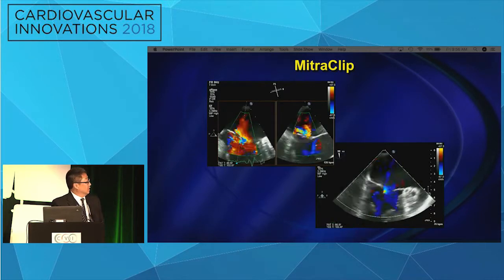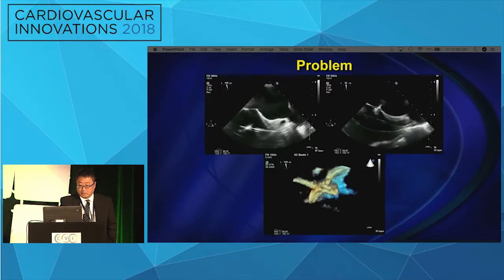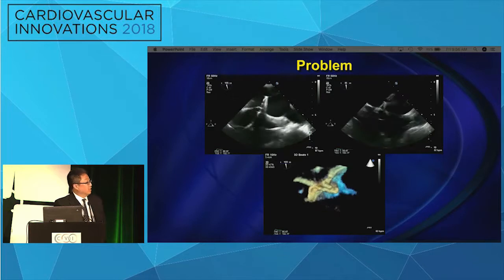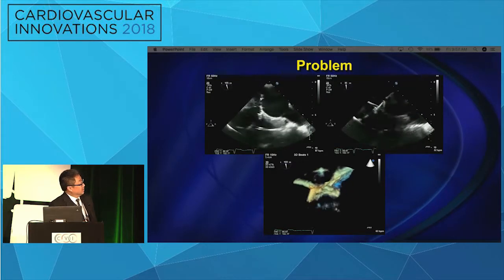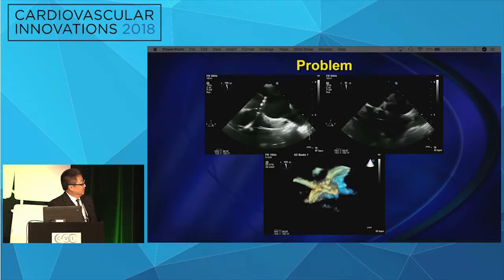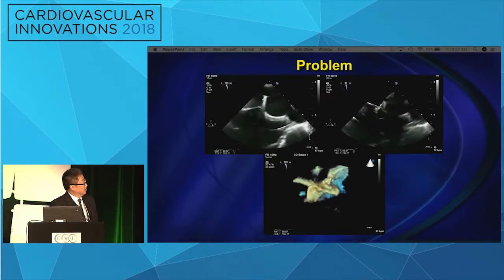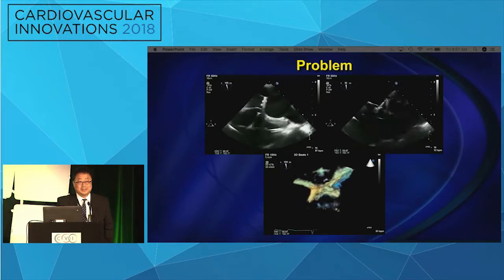This is a patient with mitral regurgitation who came for mitral clip, and one clip was placed with a reasonable result. The issue was during the procedure 2 years ago, during device prep, the handle wasn't pulled back, and that contributed to us getting stuck across the atrial septum. The guide you can see in the upper right is on the RA side, and the clip is on the LA side, and it just got stuck. You couldn't advance it, you couldn't withdraw it, and that caused a lot of consternation. Has that happened to anybody before? No? Okay.